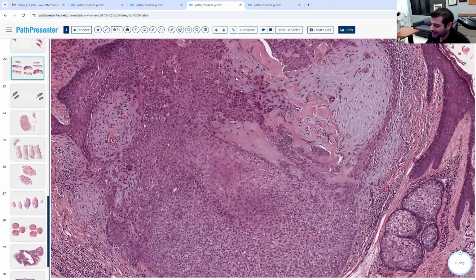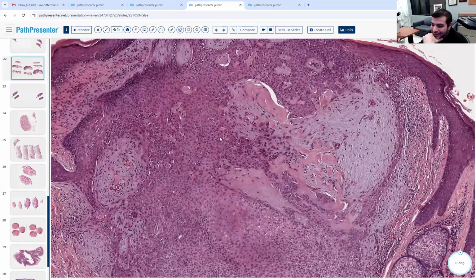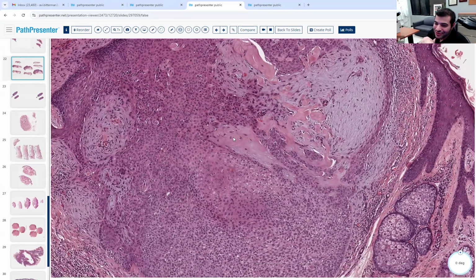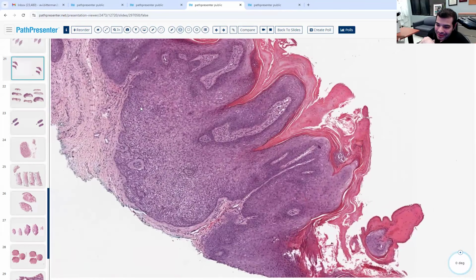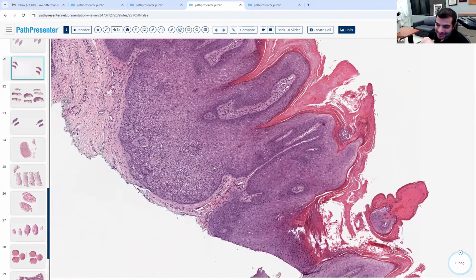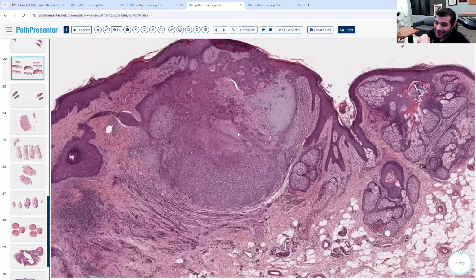I think the etymology of desmoplastic is desmos. Anyone know desmoplastic or desmos? Anyway, this is the reason why it looked ugly to you. It looked ugly to you because it has this area of desmoplasia. And that's why the stroma was off. This looked fine to you because it didn't have that. But really, this is just the same thing. Now imagine I put a bunch of hyalinized stroma in here. If I put a bunch of desmoplastic stroma, what would it look like? Kind of like this.